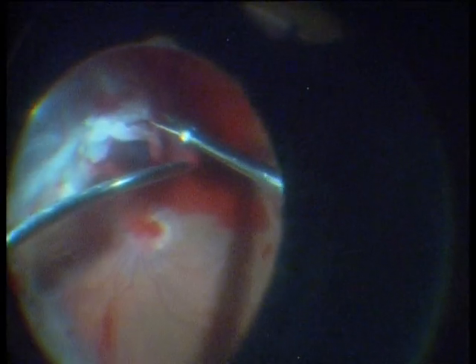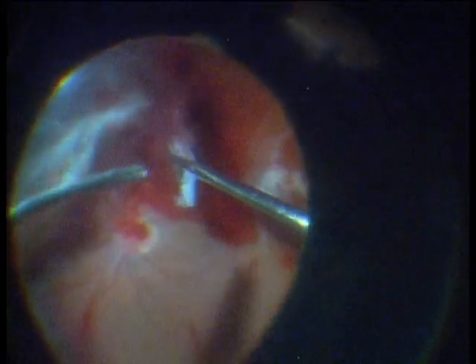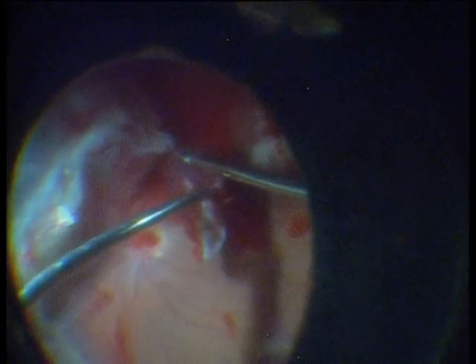Again, you see how important the bimanual technique is, especially for these very difficult diabetic cases. Now the last fibrovascular membrane is removed with final cuts of the straight vitreous scissors and removal of the membrane with the vitreous cutter. With this en bloc technique, we could remove all the membranes, so that a later detachment of the retina is quite unlikely.